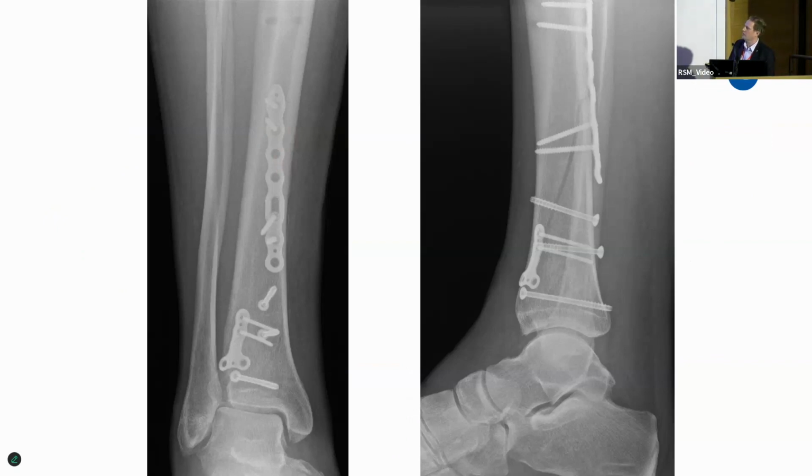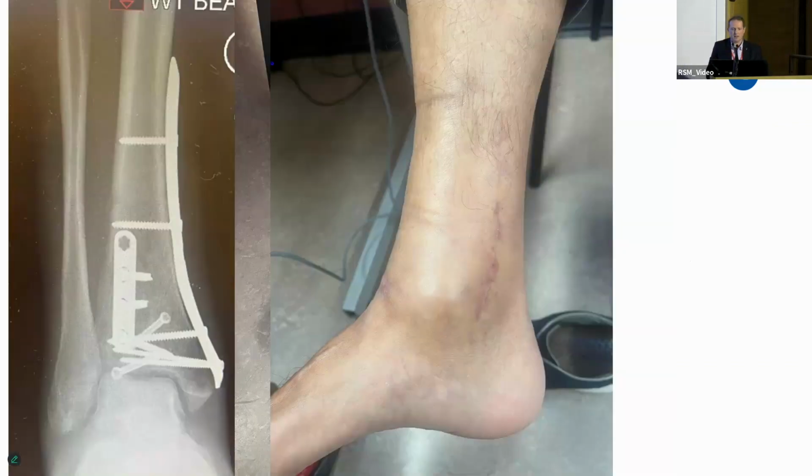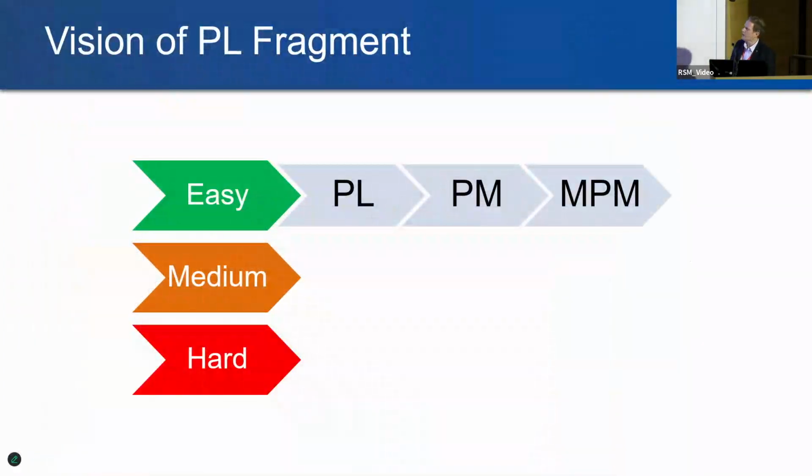I don't use this type of metalwork now. And fixation at the top end, you can do that through these incisions because of the fasciotomy line. And even your medial column pilons, as you can see here, and also because the incision is not over the top of the metalwork, it's a lot safer on our medial incisions. Okay, so to put this together, the posterolateral fragment is easy through posterolateral and MPM.